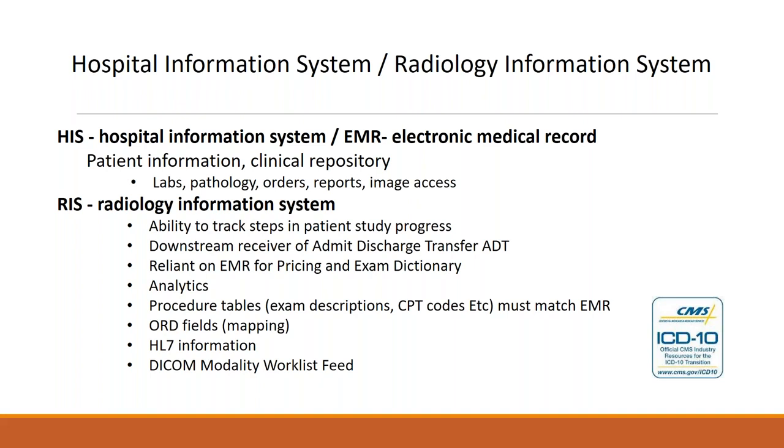Analytics, depending on how good your RIS is and how good your staff is at knowing how to pull analytics out of it, are going to be very powerful. You're going to have the ability to gain information that helps drive your business and helps make decisions. In a number of companies, and one of the ones I'm in now, we use an outside system that we connect to. So we interface with a third-party system for our analytics.